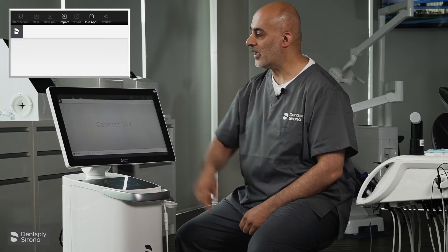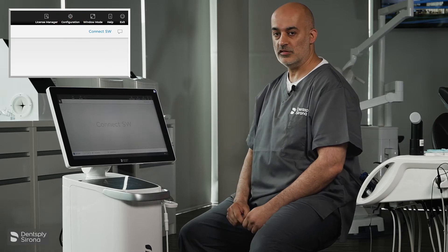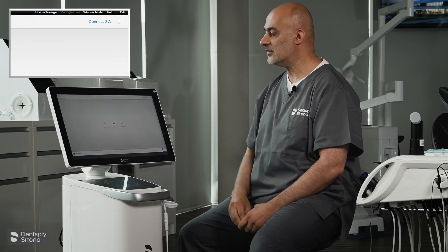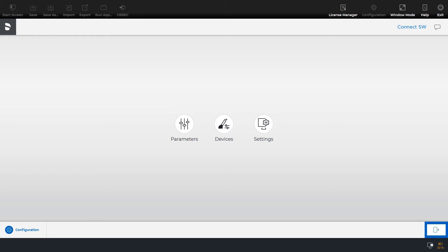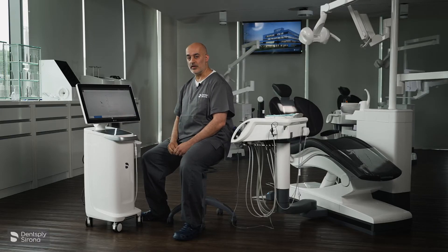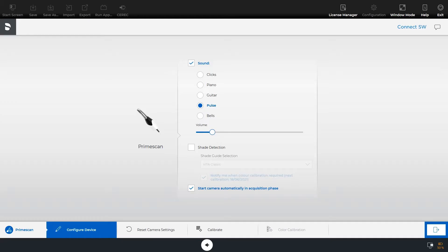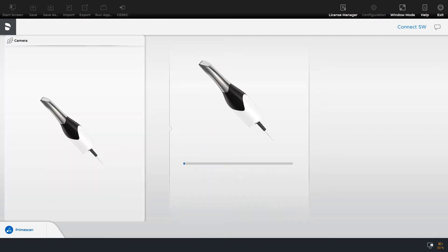We select the Dentsply icon in the top left of the screen and you have the configuration selection. We press that. You have three choices: parameters, devices and settings. We select devices and then Prime Scan. You have three choices at the lower end of the screen: configure device, reset camera settings and calibrate. Let's select calibrate.